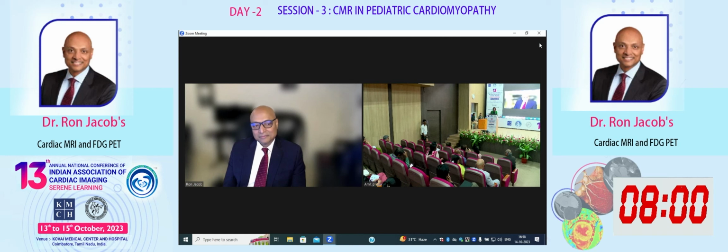So for instance, I'll just take an example. Let's say we have our T1 mapping technique. We made it, it's in our system. We know that it works, and let's say we use our phantom, we check it, and it looks like it's within tolerance range. It passed. And let's say I've done my healthy volunteers as well. I've done a bunch. I'm not going to repeat 100 healthy volunteers.